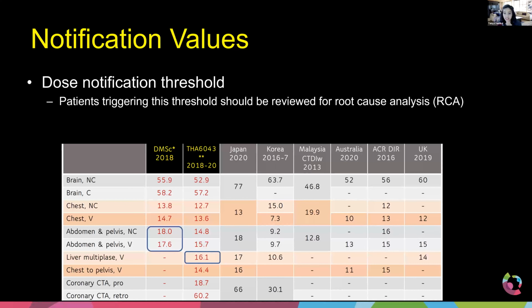And I think one thing is the key is like patient preparation to get the right heart rate, to get a good image quality. So that's why nurses can get involved and help us to prepare the patients. Yeah. In pediatrics, obviously, there's a lot of just trying to keep the patient calm.